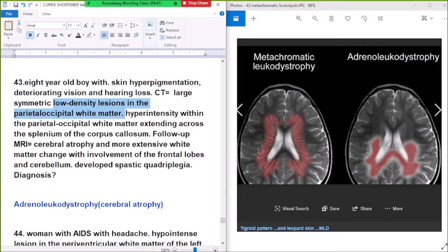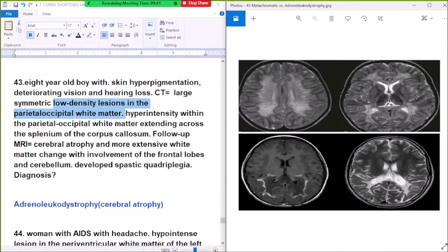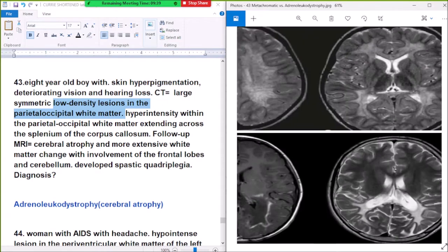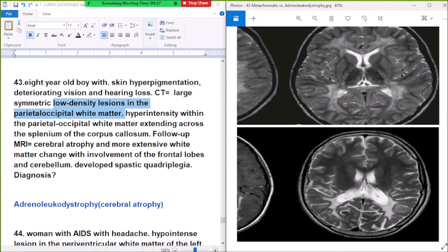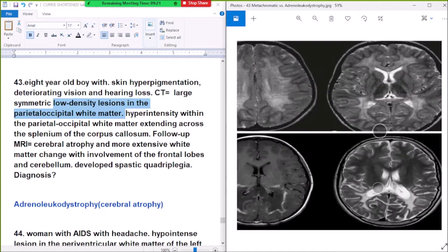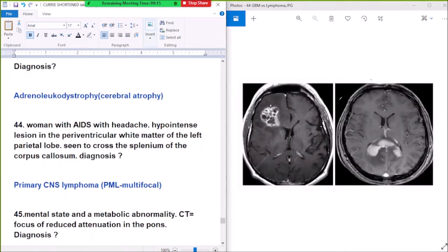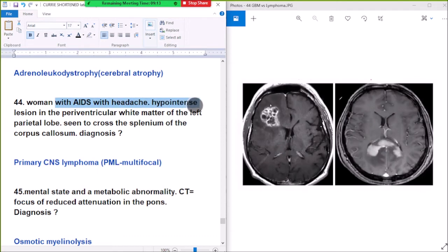Large symmetrical lesion in the occipital white matter, hyperintense in the periventricular white matter extending across the splenium of the corpus callosum. Follow-up MRI shows cerebral atrophy and more extensive white matter change with involvement of frontal lobe and cerebellum. Diagnosis: Adrenoleukodystrophy.